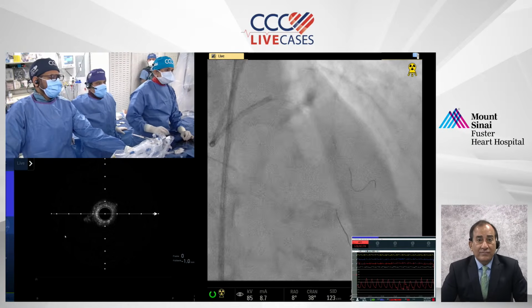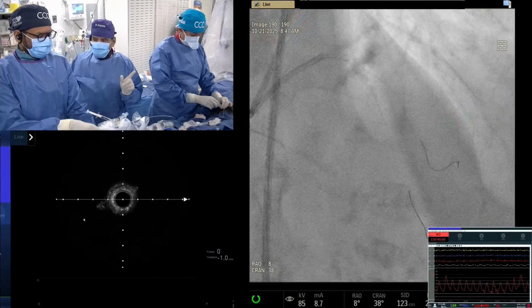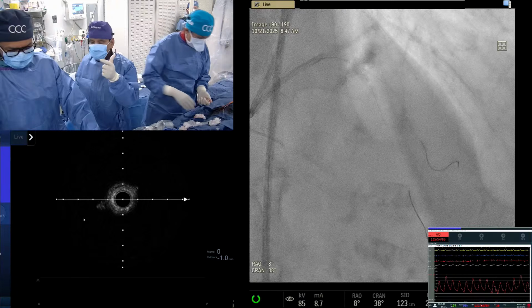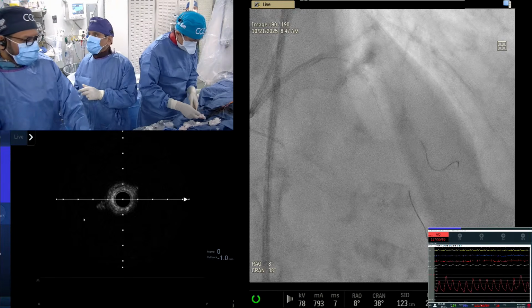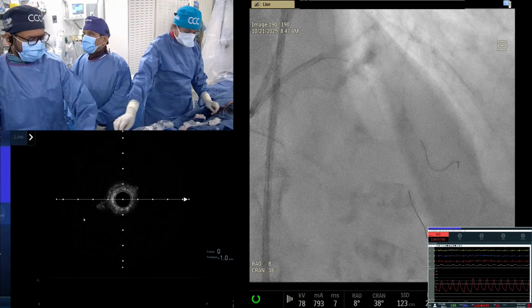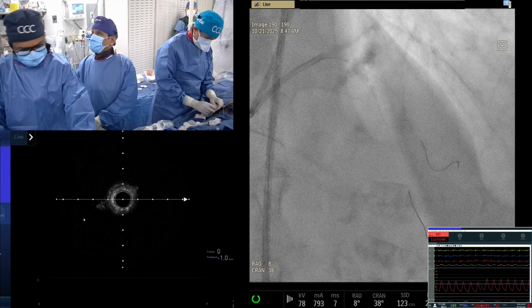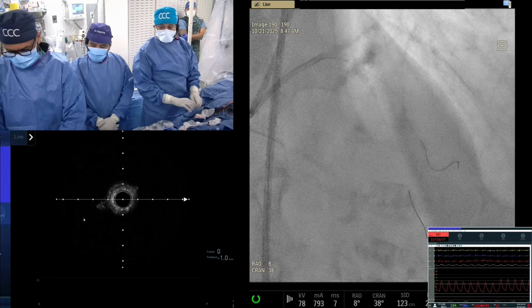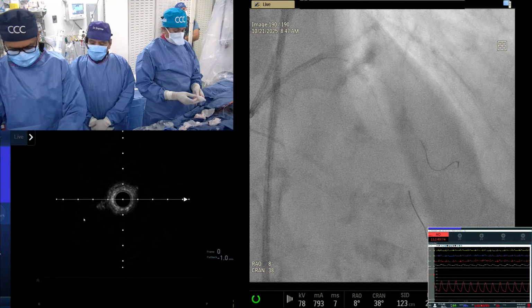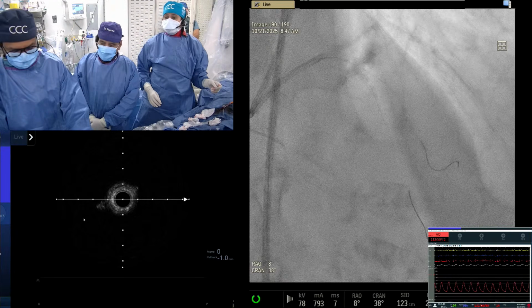Yeah, and that is why I say the big issue happens. Now here, it is justified to do a rotational atherectomy because the IVUS did not go. That's one. Secondly, part of the many decisions we make, IVL versus atherectomy, IVL is not reimbursed uniformly, particularly if it's outpatient, ambulatory, there is no IVL reimbursement. Some of the other companies do not reimburse IVL, which is 4,500 compared to rotational atherectomy, which is 2,000.